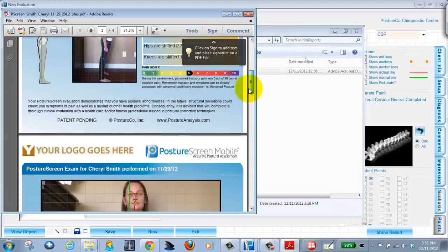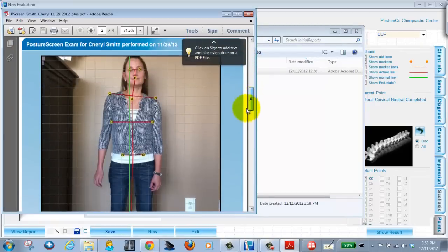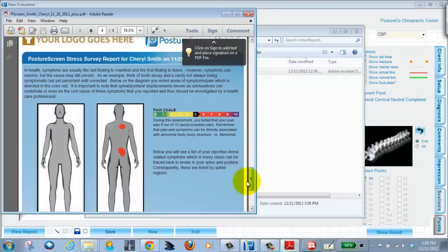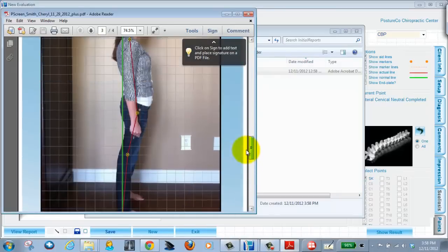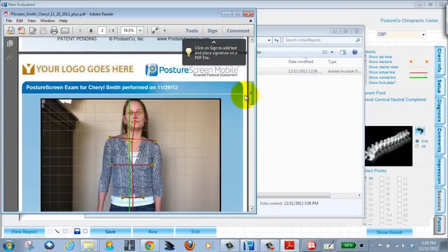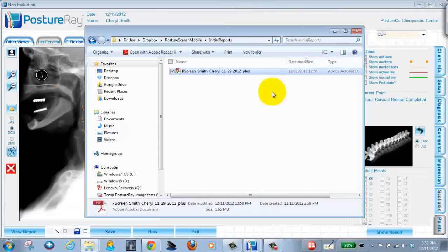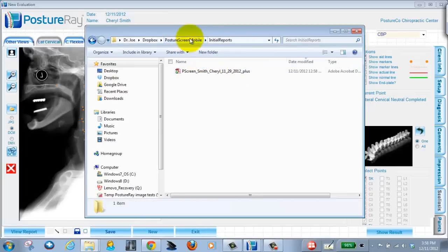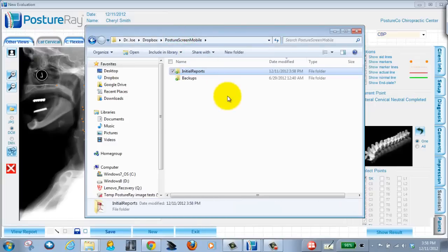But we don't want to put that in our x-ray EMR system. We want just the images, right. Okay, so what we can do is if I go back to Posture Screen Mobile, notice that in that folder there is no other image folders.